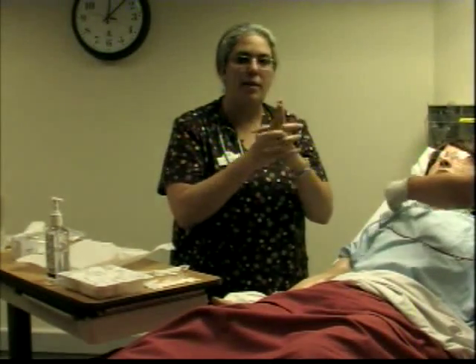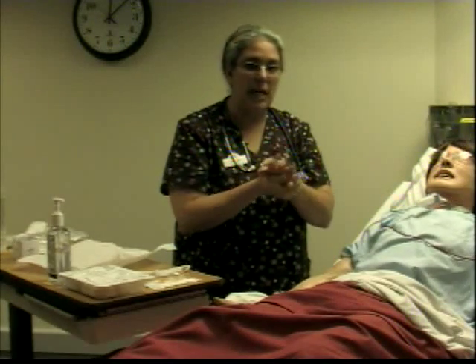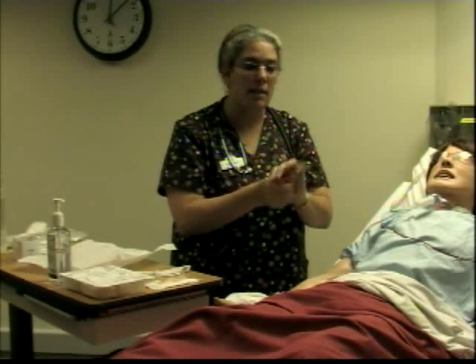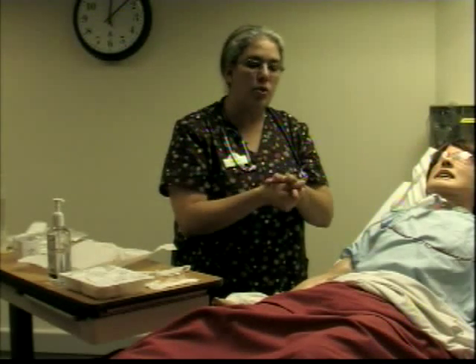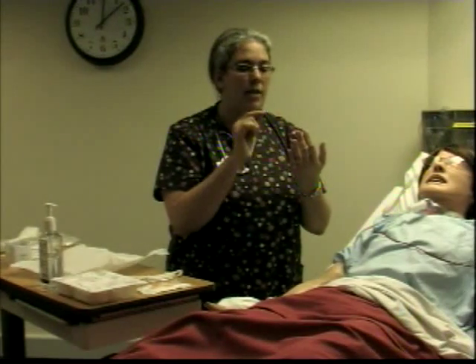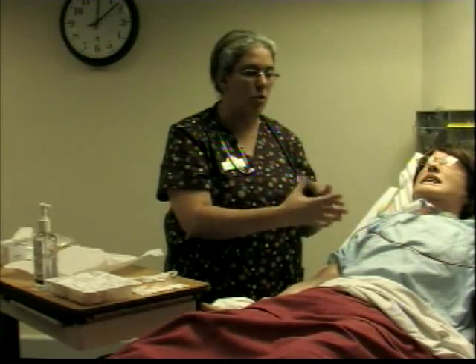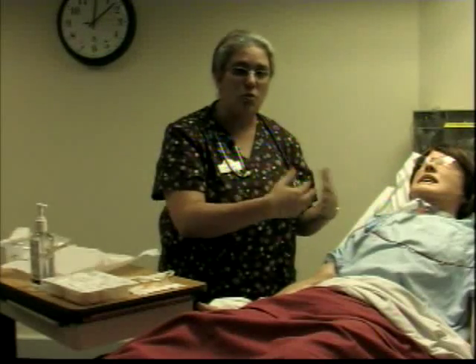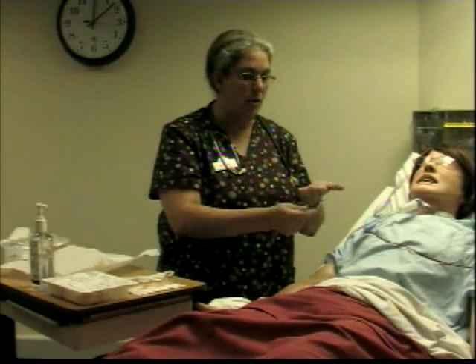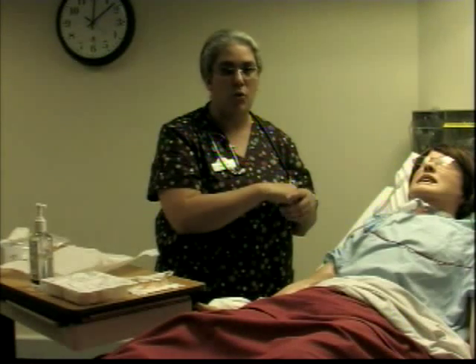You're going to evaluate big things that you need to remember. At the beginning, you want to have a baseline of vital signs and respiratory status. At the end, how are you going to know if you were effective? It's by repeating your assessment and reevaluating. So you will obtain another set of vital signs: blood pressure, heart rate, respiratory rate, and pulse ox. And then you're going to listen to her lungs again to ensure that the bronchi secretions were removed. If they're not, you want to make sure that you come back half an hour later to see if the client needs to have more suction.